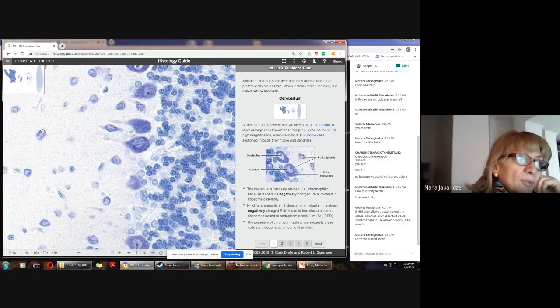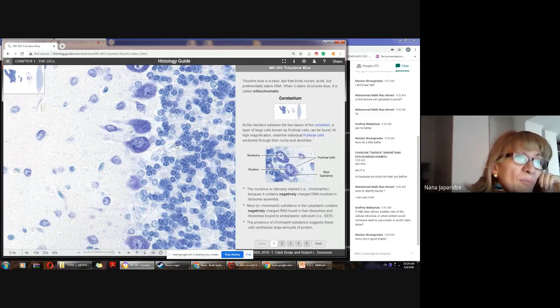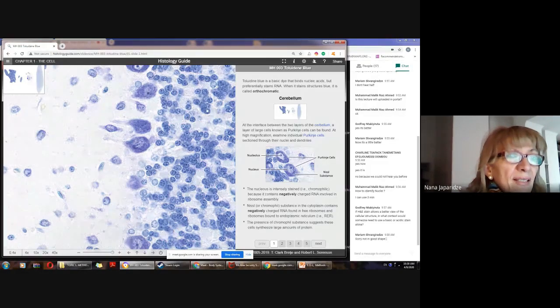Okay, so you see here the Purkinje neuron, and you see granular cells. These are also neurons. Look, but they have totally different size. They have totally different shape. Or this one, for example, or that one. Granular cells have so small a rim of cytoplasm that it is not even identifiable sometimes. Okay, here you can see the small rim, or here, look.